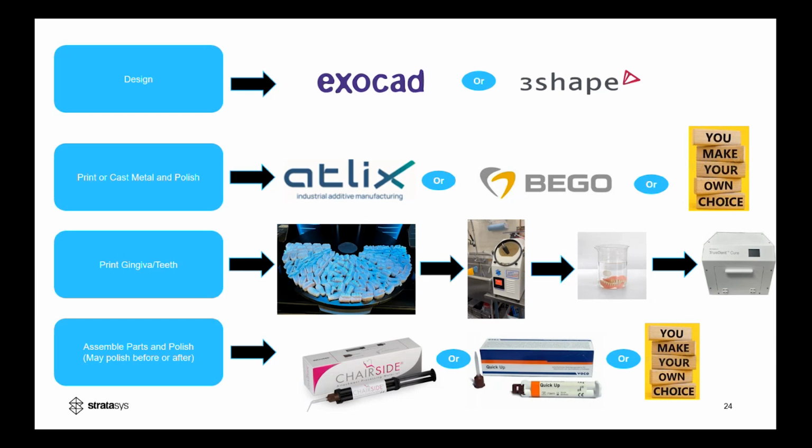We're always getting a consistent result because it's a digital design, and we always know that we're going to have the same fit, because we're taking the human error out of all of the processes that we're doing. So we found a lot of success in using this type of technique for manufacturing our frameworks and our partials for our patients. And our doctors really seem to like the product they're getting. And another thing that we're doing is we're cutting down our appointment times from 3, 4, or 5 appointments to mainly 2 and sometimes 3 appointments for a finished metal framework partial denture.